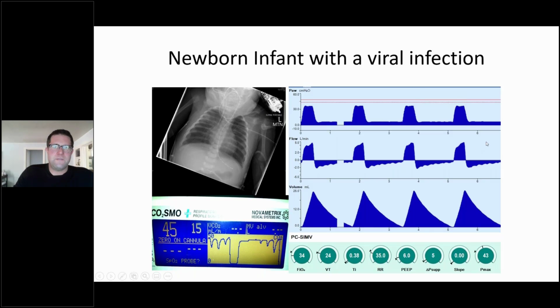This was another infant with airway obstruction who presented with a viral infection. We knew nothing else, just the fact that they came in with a viral infection. Their CO2s were relatively normal. We started seeing these clefts, these little interruptions in the swing of the magnitude of the end-tidal CO2 waveform. I remember our department director, Dave Crotwell, went up there, and we were both up there, and he said, I'm sorry, but something's going on in exhalation that's impeding gas flow out of this patient, and it's very regular. So that may actually be something underlying.